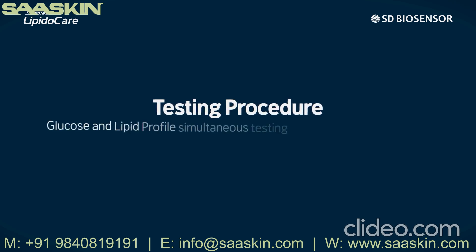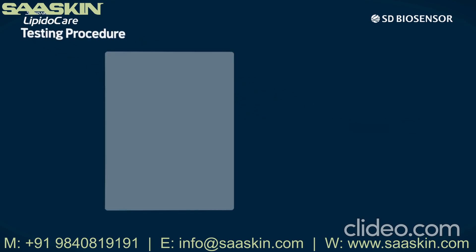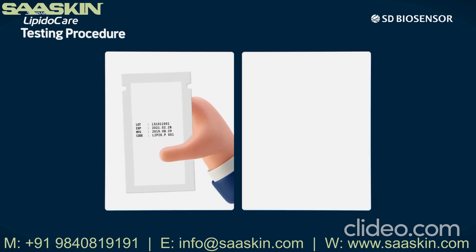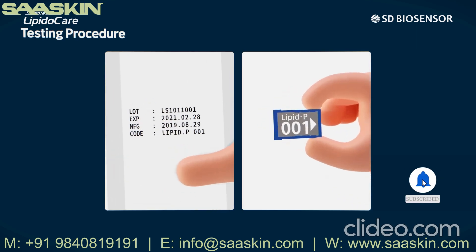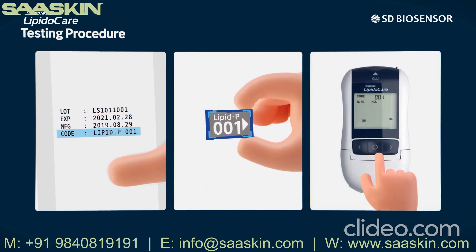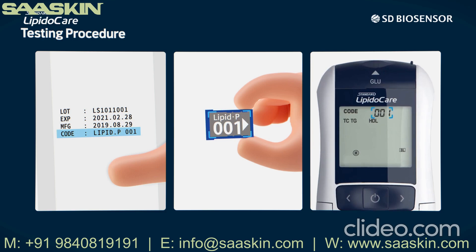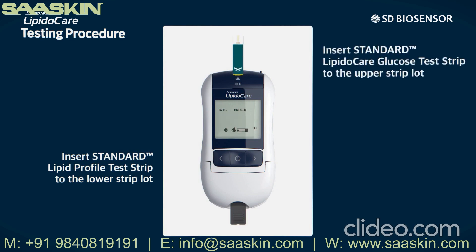Testing procedure — glucose and lipid profile simultaneous testing using capillary whole blood. First, take out the code chip from the strip package. Match the code chip number with the number printed on the individual strip package. After confirming the numbers match, turn the analyzer on and insert the code chip into the analyzer, then check if the number on screen matches the code number. Next, insert the Standard Lipid Profile Test Strip into the lower strip slot and the Standard LipidoCare Glucose Test Strip into the upper strip slot of the analyzer.